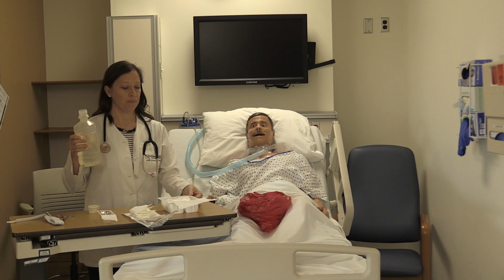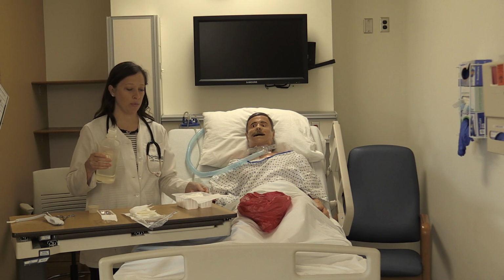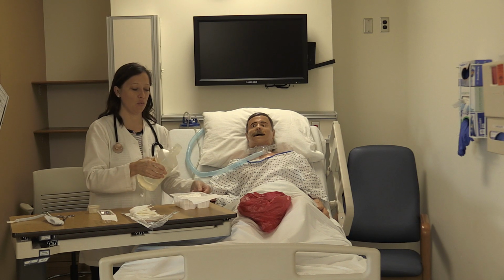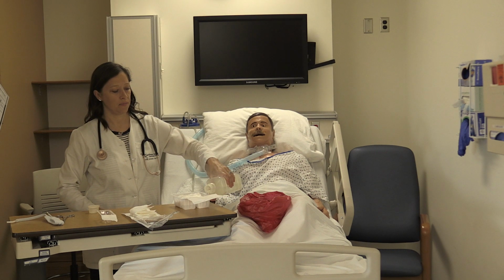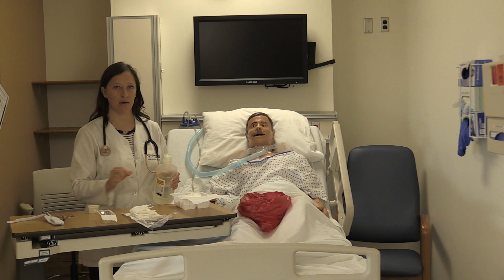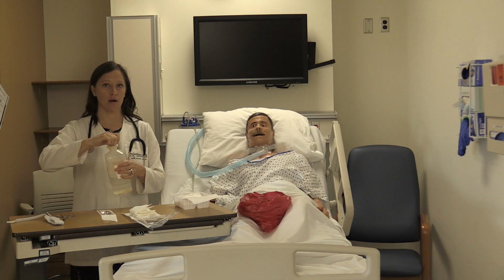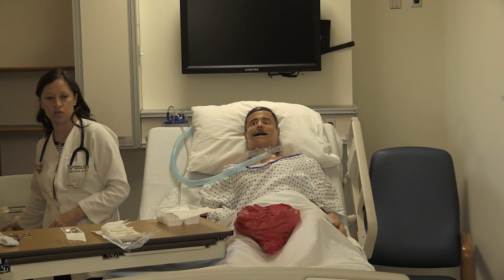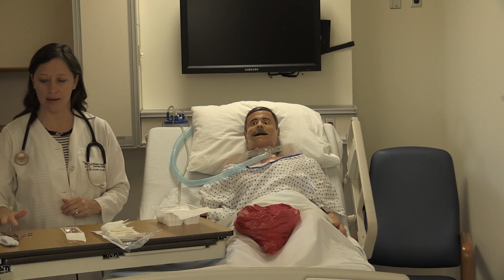So I have two basins in my kit, and I'm going to utilize both of these. One is for cleaning and one is for suctioning. Being careful not to touch anything on the inside portion of my kit. So now that I'm done with this part, I'm going to go ahead and just set this behind me, making sure not to turn my back to my sterile field. I just don't want a lot of extra things on my table.